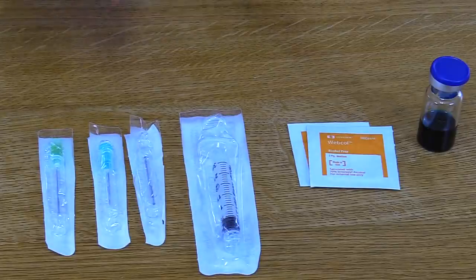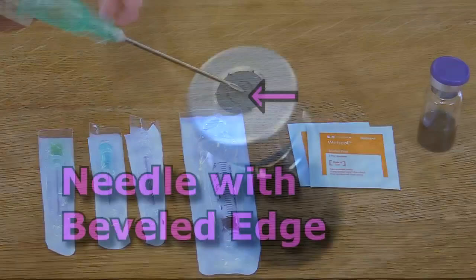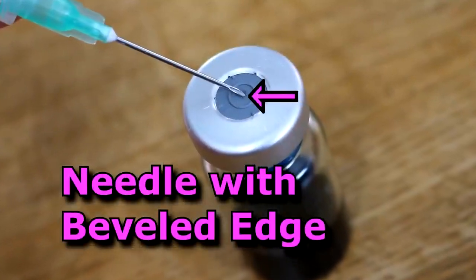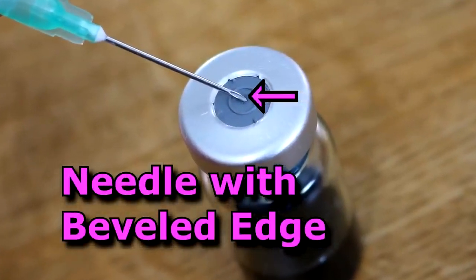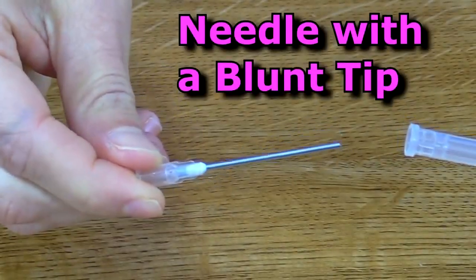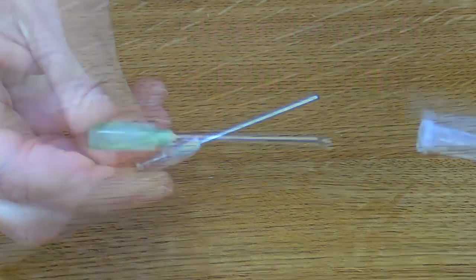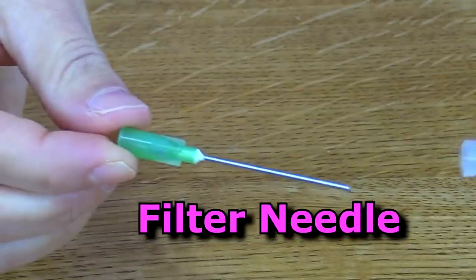Now you can use different vial access devices to withdraw the medication from the vial. One type of device is just a plain needle with that beveled tip. Another type is a blunt tip fill needle, and this can be used to decrease needle sticks during medication prep, or a filter needle can be used.